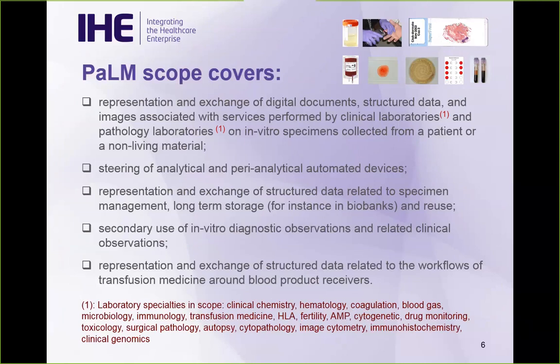We're working with DICOM to make sure that we have proper domain knowledge of the DICOM standard when we're dealing with that. And Dr. Dash will talk more about that. And then it also includes transfusion medicine, and as you will see, it's one of the newer profiles we've been working on. Next slide.